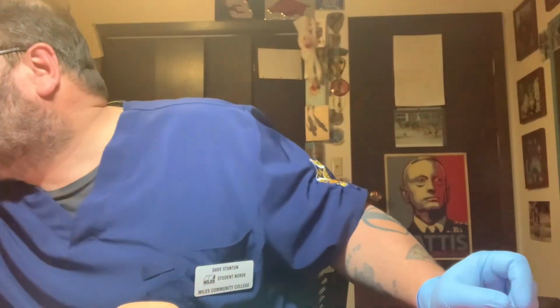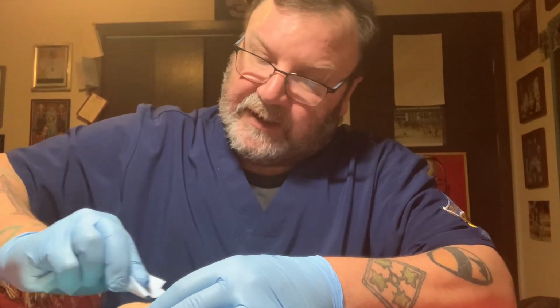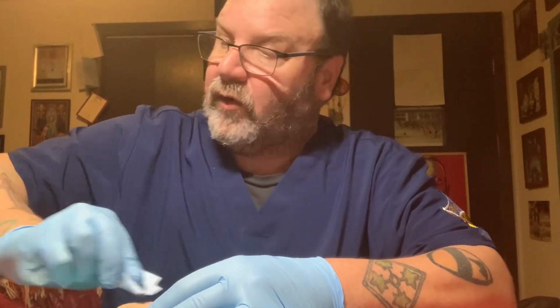I would take my antimicrobial swab. We've been through it today with them. So I would take my antimicrobial swab. This is going to be it. And starting in the center of my injection area, I would swab and work out.